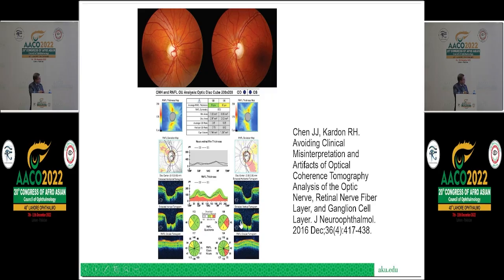And if you look at the rim, it still looks pretty even all the way around. You might say to yourself, look, there's some problem here, right? Superiorly and inferiorly. But this is actually because of the way the blood vessels come in, rather perpendicular, with the vascular pattern almost 90 degrees as opposed to oblique. So it creates artifact also. So this is not actually real pathology, it's just a bit of artifact. And if you look at the nerve fiber bundles and the segmentation, it all looks pretty good. And this is a pretty normal physiological rather than pathological disc.